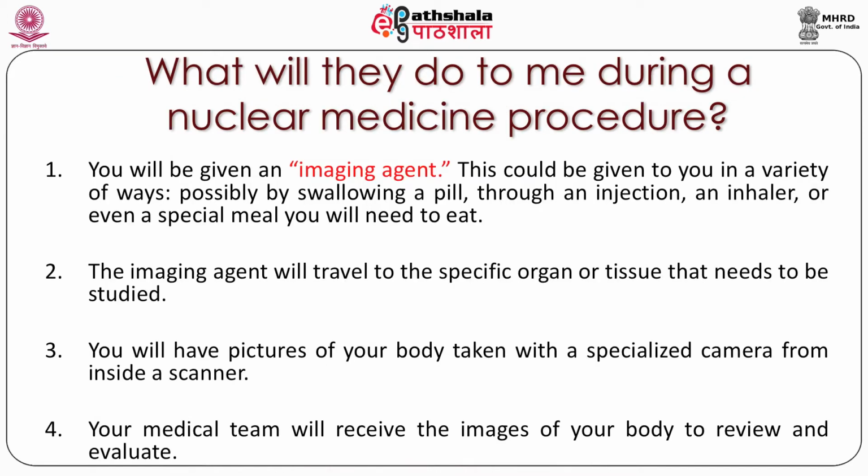What will they do to me during a nuclear medicine procedure? This is the important question which comes to the mind of a patient. He would like to know, he wants to understand what is going to happen whenever the nuclear medicine procedure is being performed. You will be given an imaging agent, as we are talking about a radiopharmaceutical, which will not do any harm to you. This could be given to you in a variety of ways, possibly by swallowing a pill, through an injection or inhaler, or even a special meal you will need to eat.